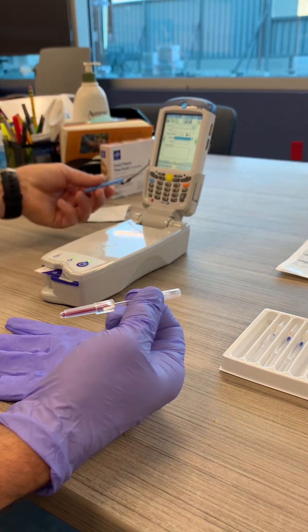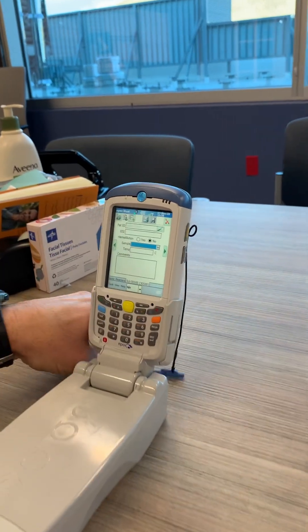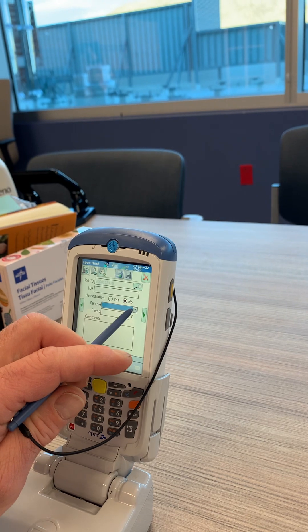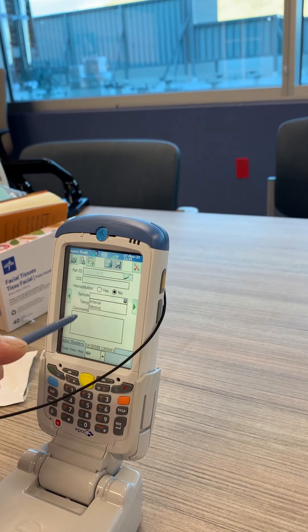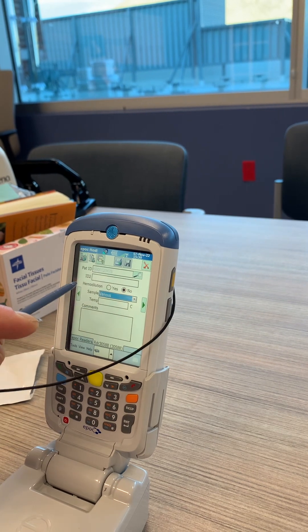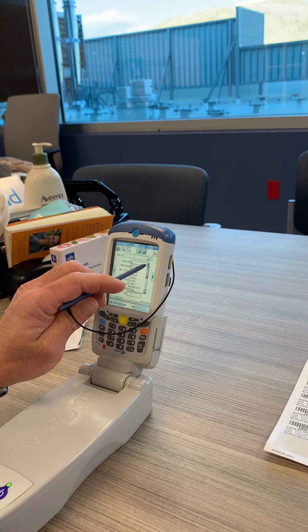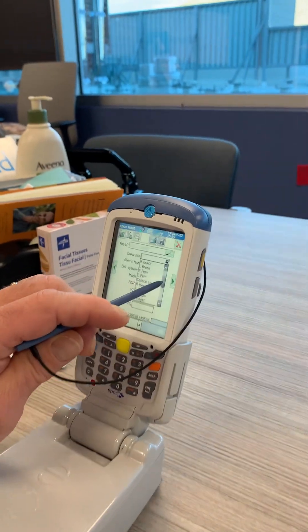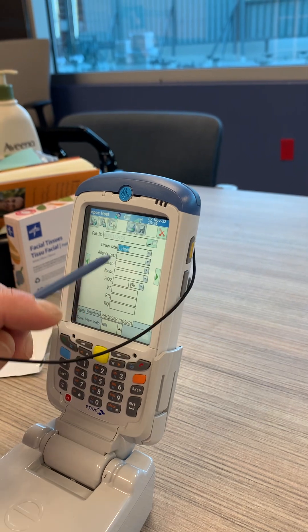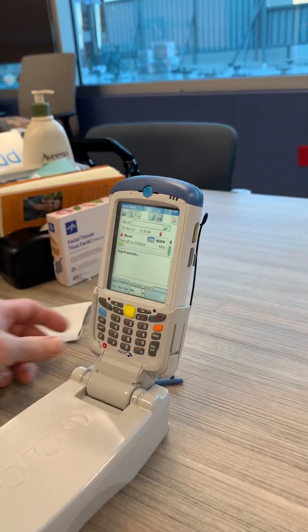When choosing the sample type, at this point we only have arterial and venous. According to the lab, they're going to have a capillary option soon, but at this point you're just going to choose venous. Then we go to our draw site — we would choose heel, left or right. Let's just go left. And then we'll go ahead and introduce the sample.